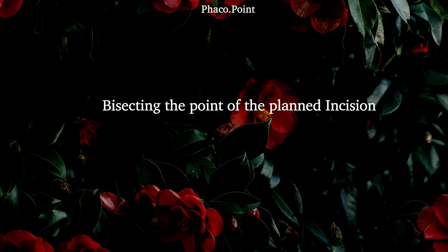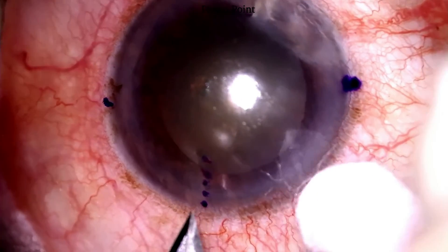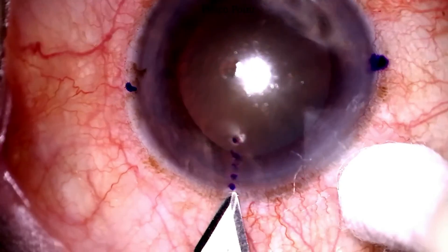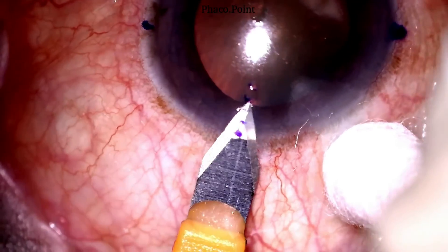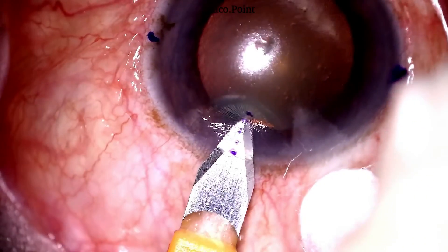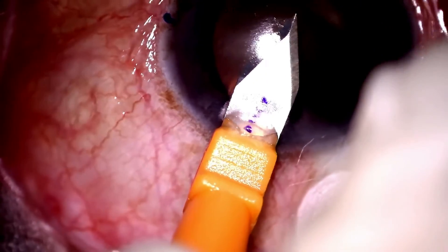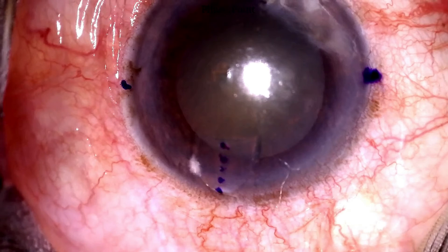Let's now see what we mean by bisecting the incision location. This is something I do for my toric IOLs. So if the incision was planned at say 65 degrees, as in this case, note how I make my incision right in the middle so as to ensure that half the incision is on the left of the planned clock hour and half of it to the right. This is what I mean by bisecting the planned point of the incision.